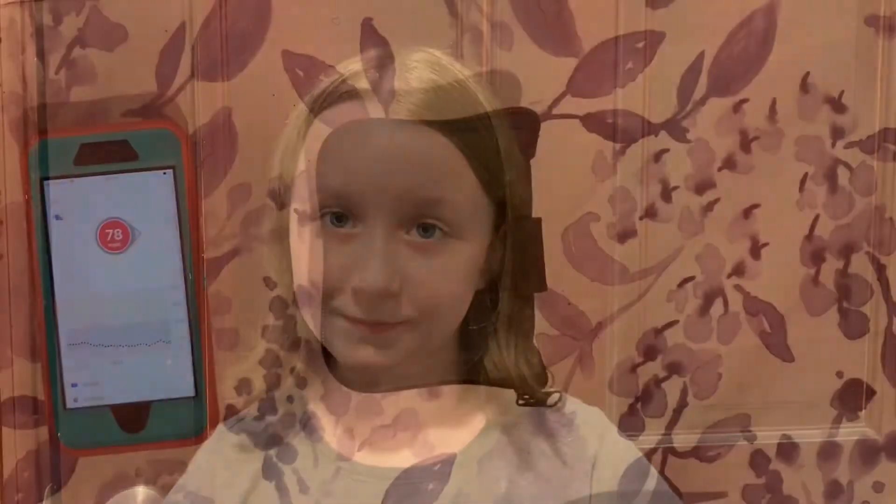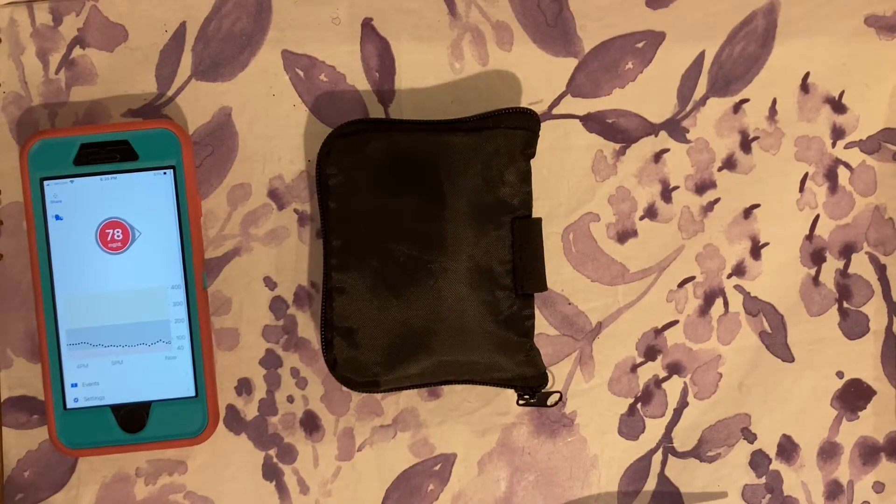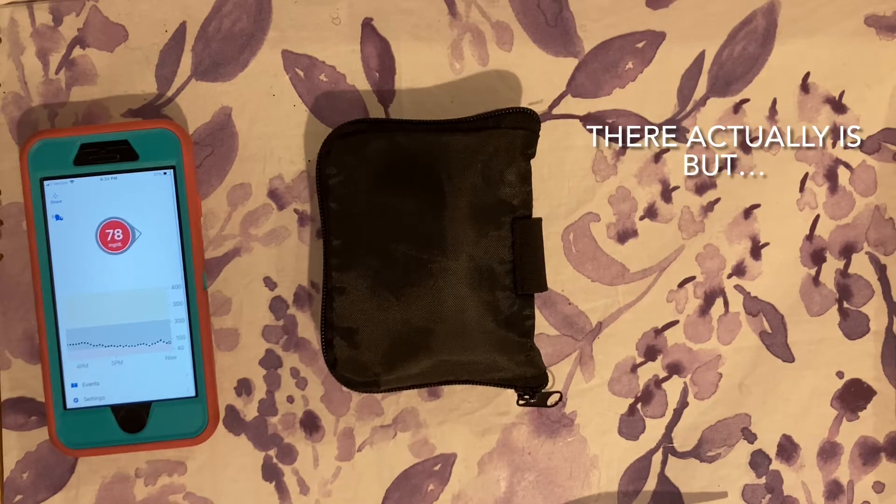Today I'm going to show you how to calibrate a Dexcom. This is mostly important when you've recently installed your Dexcom — I installed this one this morning and I need to make sure it's giving me accurate readings so that when I eat I'm not giving too much or too little insulin. I'm actually a little lower than usual right now — I'm 78 and steady — but this is my first day wearing this Dexcom so there's no way to know if I'm actually 78.